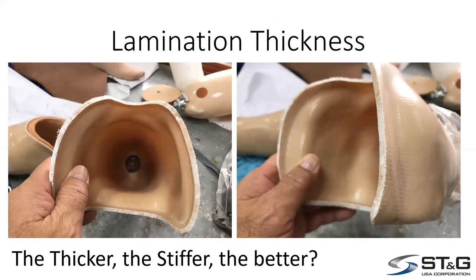I've seen many different types of sockets. I've been fortunate to travel around the world and visit many labs. And one of the things I like to do, just out of curiosity, is look around and see how everybody's doing things. So here we have a socket, and this socket was about a quarter of an inch thick, about 6 millimeters. And it was primarily nylon stockinette.